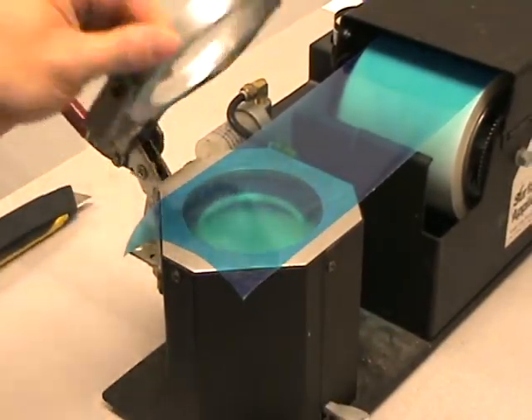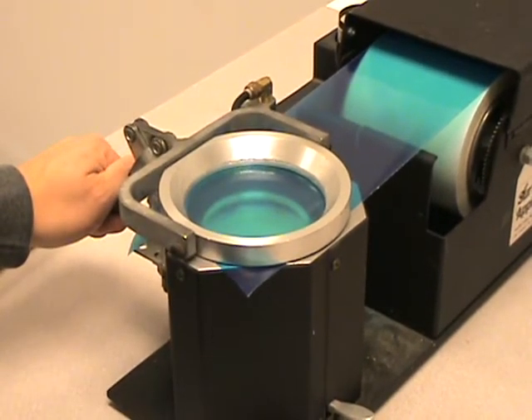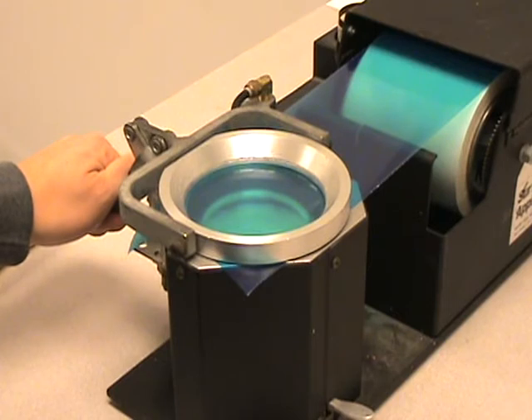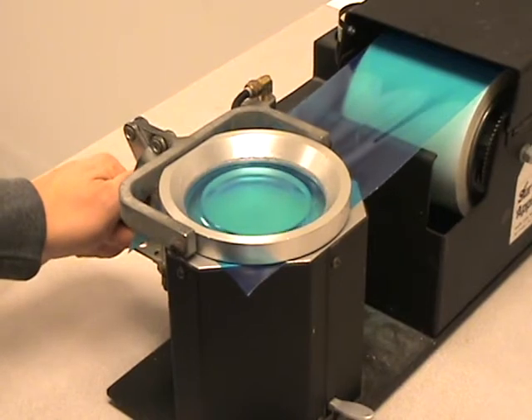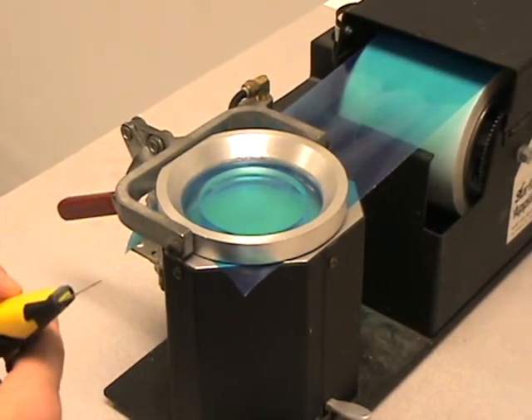At that point we're going to close the lever and then push down on the red handle, which is going to activate the suction, which will raise the lens to touch the sticky adhesive part of the tape. We will let off of the suction once it comes up and makes good contact.